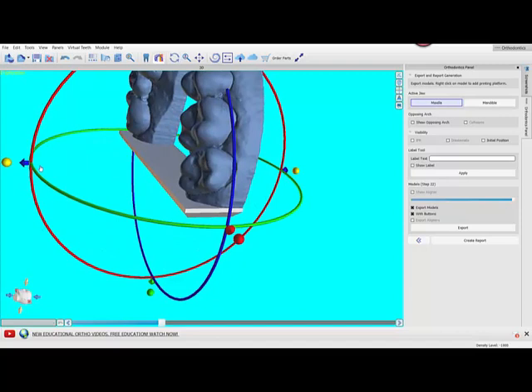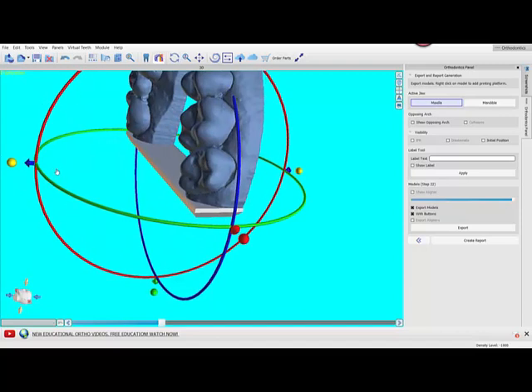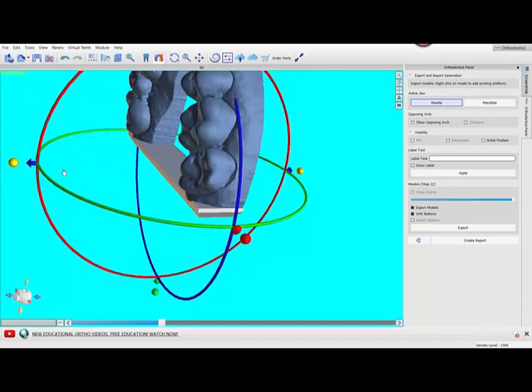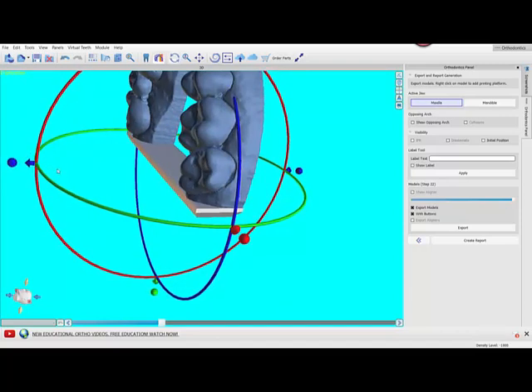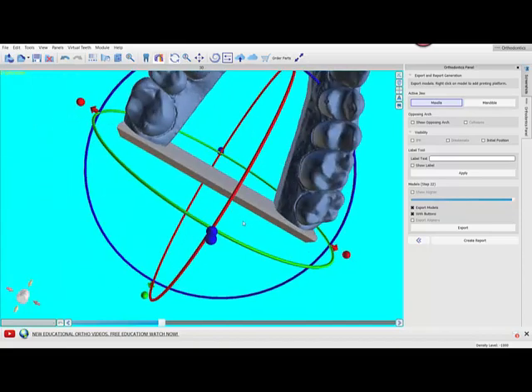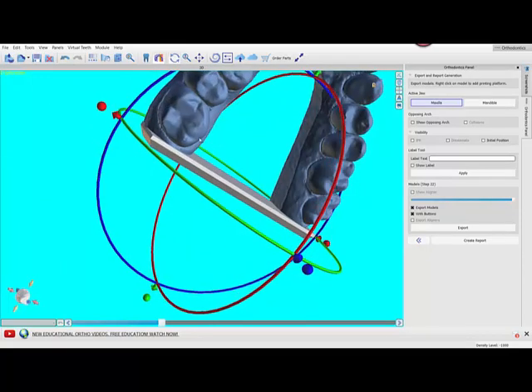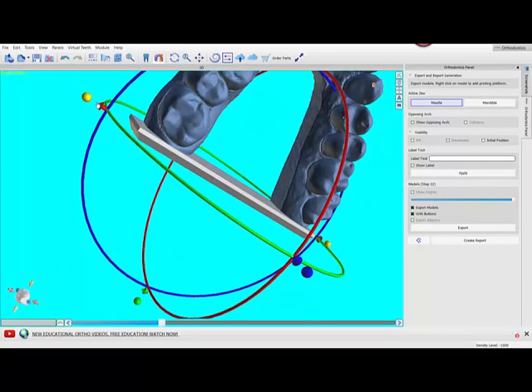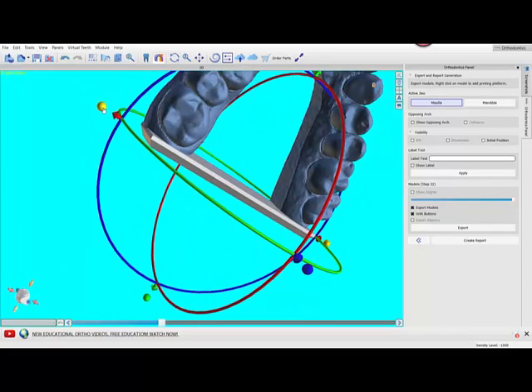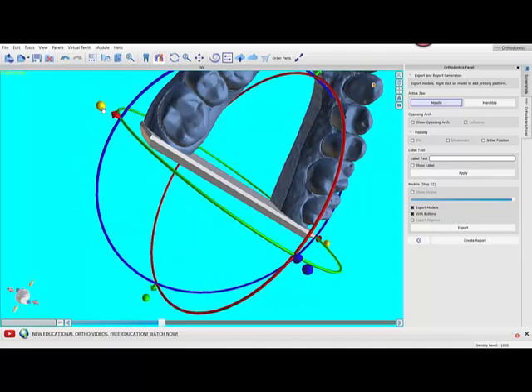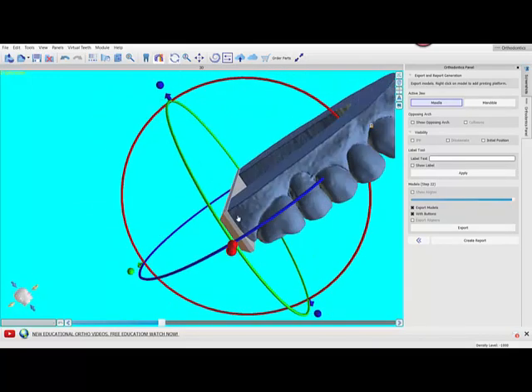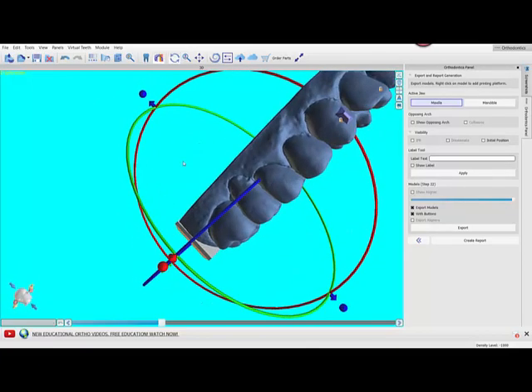I'm going to do the occlusal aspect, making sure that both heels are embedded—it's usually one slightly taller than the other. And then lastly this side, it's actually pretty good. Just to give you some perspective, I find that usually one side and the apical aspect are good, not always both one of the sides.